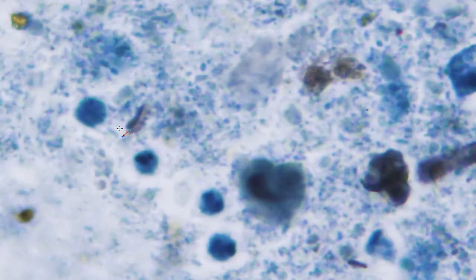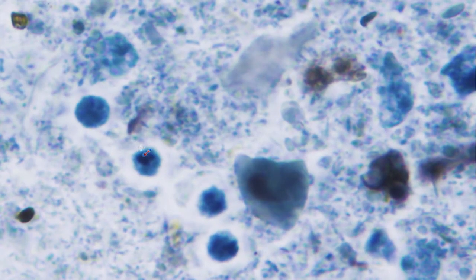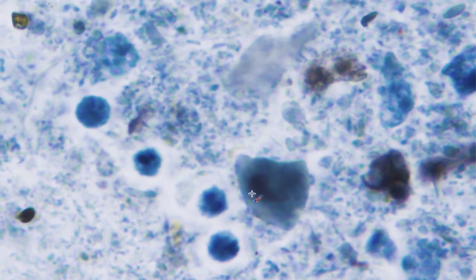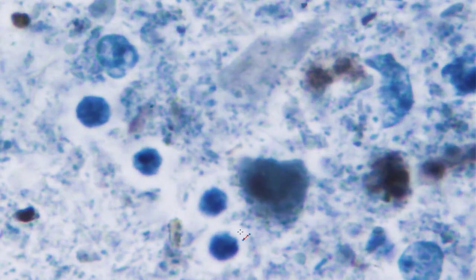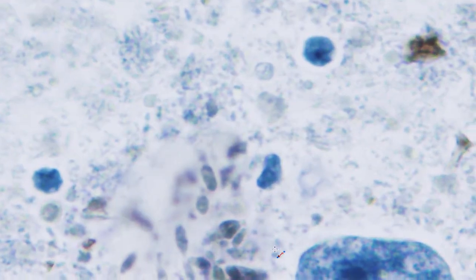So you can see all of these protozoa here. There's a lot of them. And they're quite shrunken, unfortunately, but this, if we measure the halo, is 8 micrometers. And you can see within it these rounded chromatoid bodies. Those are actually cysts of Entamoeba hartmanni. Now there's a lot of chromatoid bodies in here. I'm sorry it's in very poor shape. You can't see it very well. Something I've observed about hartmanni is you tend to see a lot of chromatoid bodies.